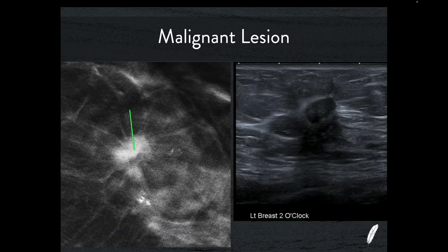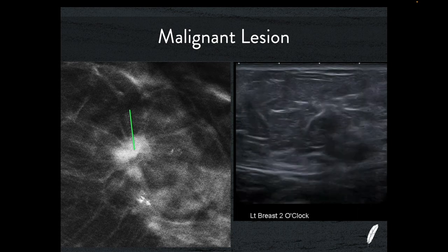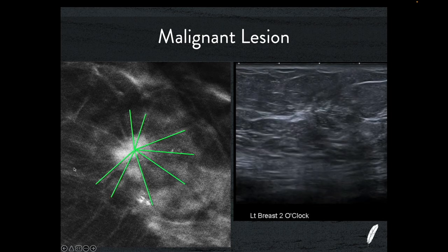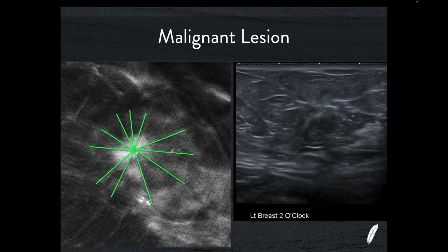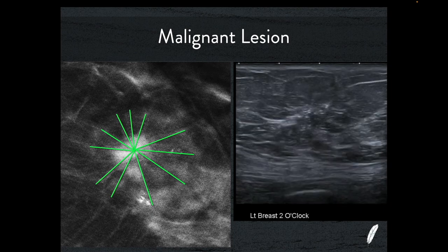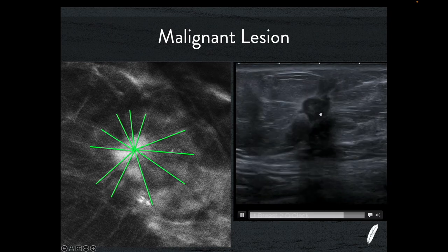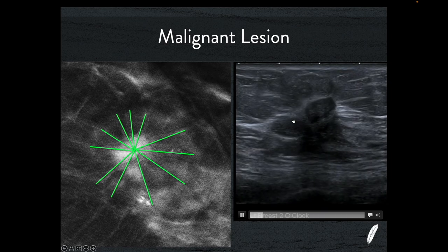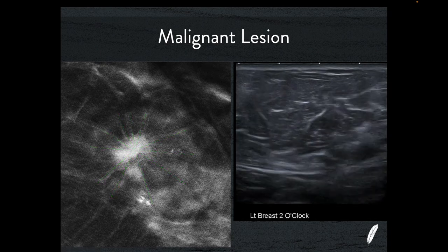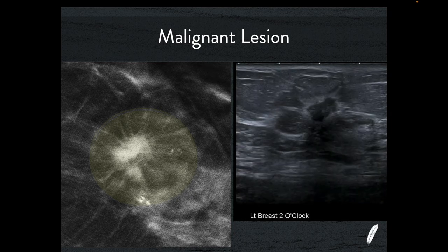This is your classic breast cancer — hypoechoic, hypervascular, with the echogenic rim, fairly attenuative, spiculated, cutting through those horizontal tissue planes in an unruly fashion. This is a really great example with perfect correlation with the mammogram — this tomographic mammogram shows the lesion with this spiculated type pattern where the invasive process appears more extensive than the central nidus of the cancer itself. On the sonogram you can see exactly the same pattern — spicules running out through the tissue in a radial fashion. Looking at that mammogram carefully, I think those dimensions represent the invasive margins of this breast cancer, not just the central nidus.